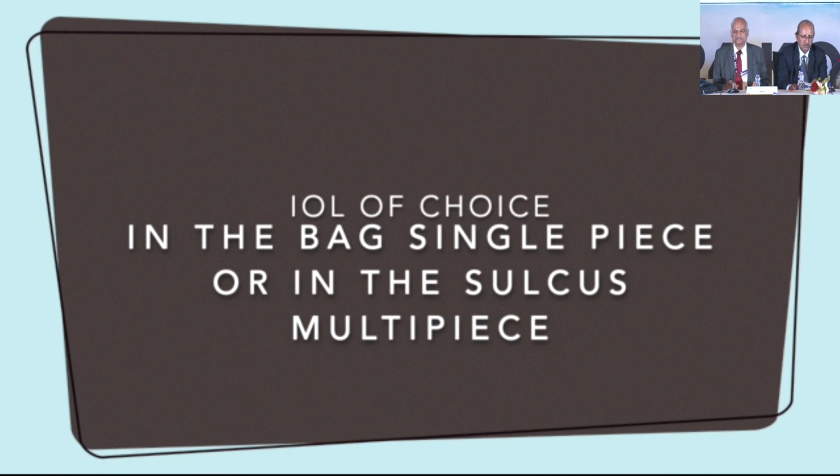So what happens sometimes, if your cortex has gone behind and the patient is not having much hypertension, or the intraocular pressure is not high, sometimes vitreous will not come up. So that is hypotony. Because of this hypotony, vitreous will remain there. And if vitreous is not coming forward, then the tear will not get increased. So that happens in a few cases.